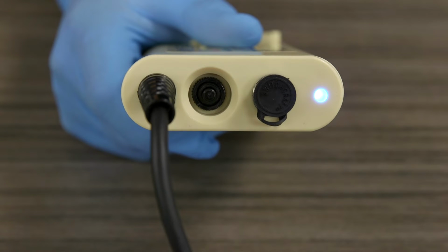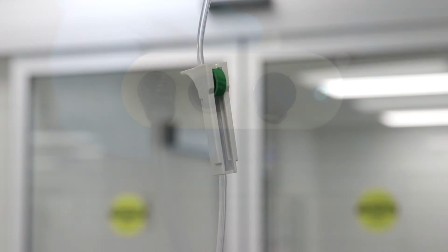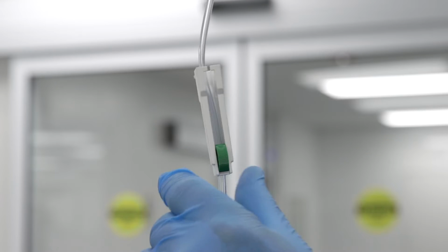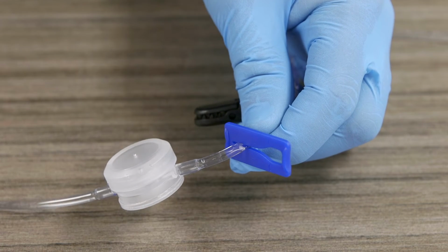During an alarm condition, blue and red LEDs will flash and an audible alarm may be heard. For questions about alarms, refer to the Alarms and Alerts section. At the end of the procedure, close the roller clamp on the administration set off, and then close the input end of the disposable set off using the blue side clamp.